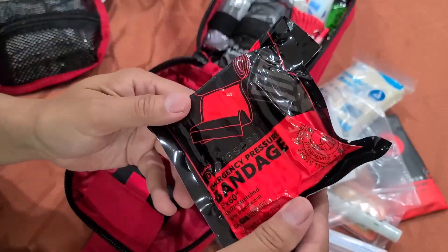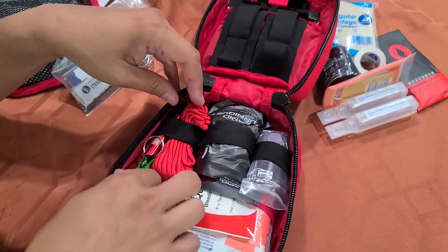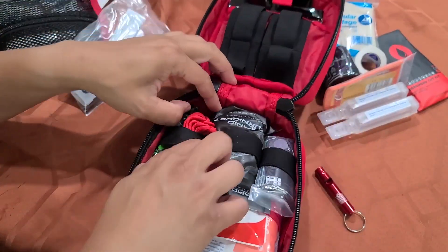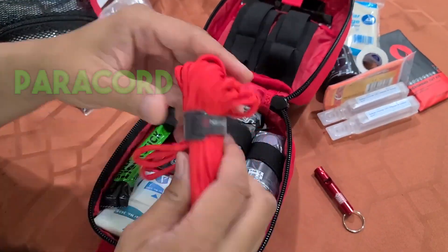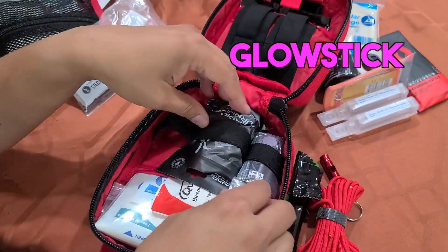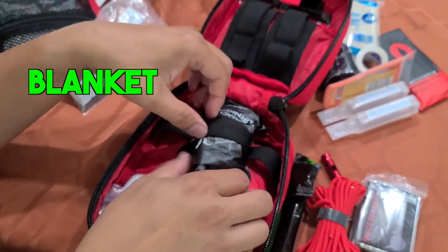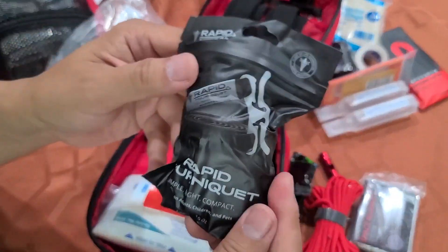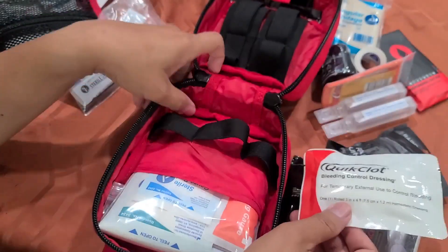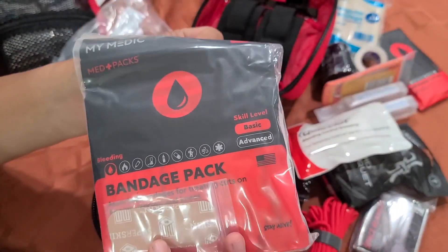An emergency bandage. You've got to have a whistle for emergencies — to call out. Paracord, which has tons of uses. A glowstick. A blanket — got to have the blanket for people in shock. The tourniquet, which is really important and not in the regular kit. Quick clot. And more bandage packs and various bandages.